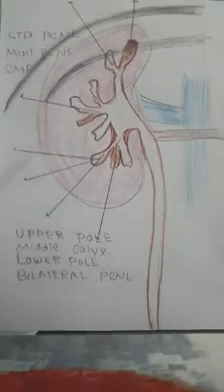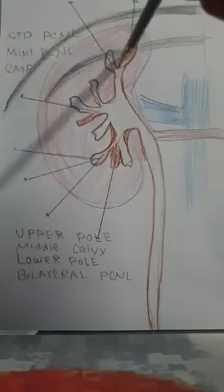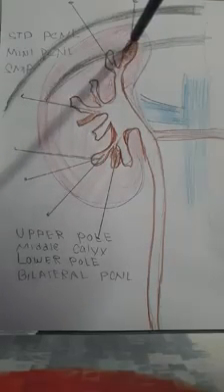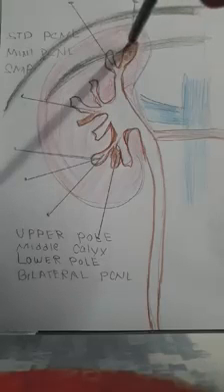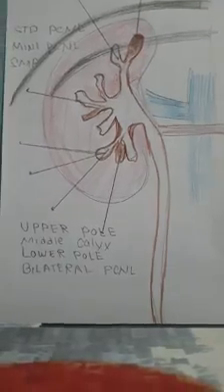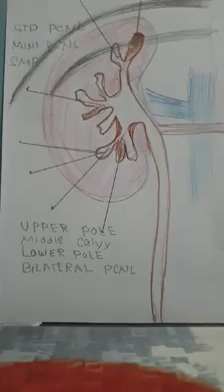30 degrees. By looking at 30 degrees, you exactly know if you are in the calyces, you are deep, or you are superficial. If I'm superficial, I'll go a little inside. If I'm deep, I'll just pull up my needle. By doing so, it's so reproducible that you can easily get access even with just one puncture. You don't really need multiple punctures, because this is a very predictable way of puncturing the kidney.